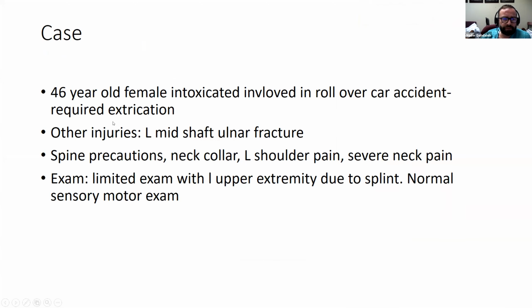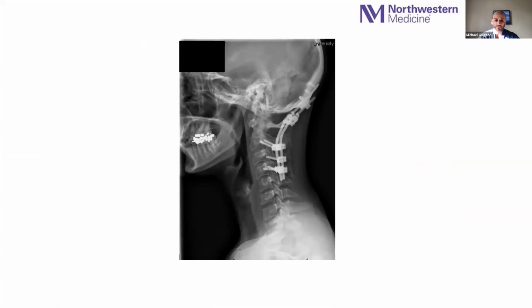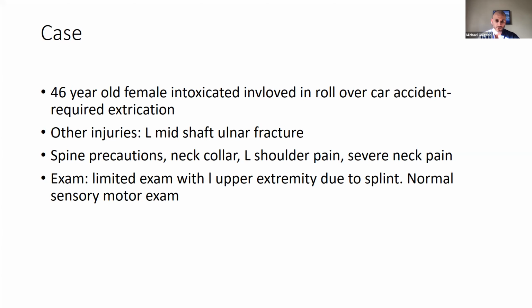I have a quick question for you, Nader, if you have a second. What are your thoughts about these cases where somebody comes in and the CT scan doesn't show a significant distraction of the OC1 joint, but you get an MRI scan and it shows that there's STIR change in the apical alar ligaments, there's some STIR change within the OC1 joint, but there's really no significant distraction. How do you treat those patients? Do you treat them with surgery, or are you going to treat them in a collar for several weeks?